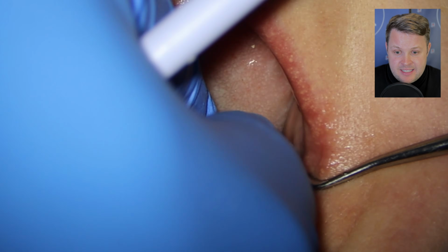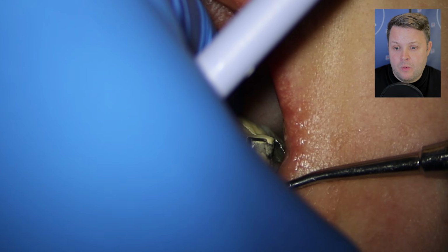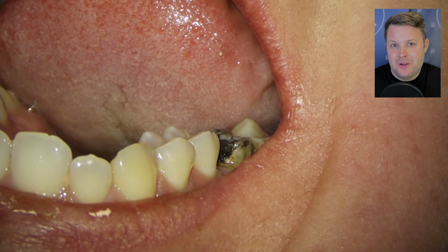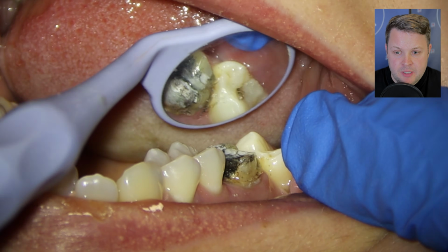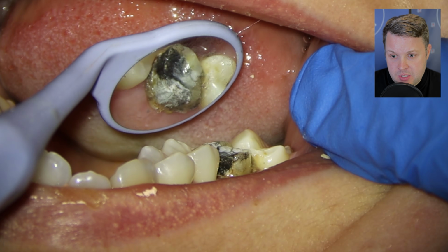You can see here that it's using a little bit of ultrasonic action, and the crown is now quite loose, and it pops off really, really nicely. And we make an assessment of what's left, and there's a massive, massive core in this tooth.